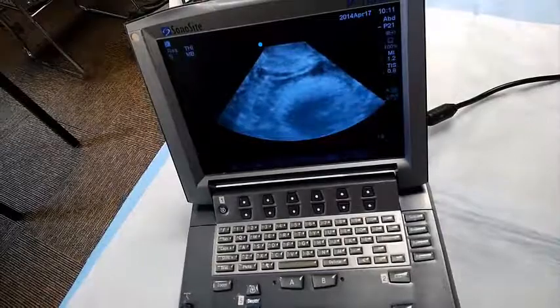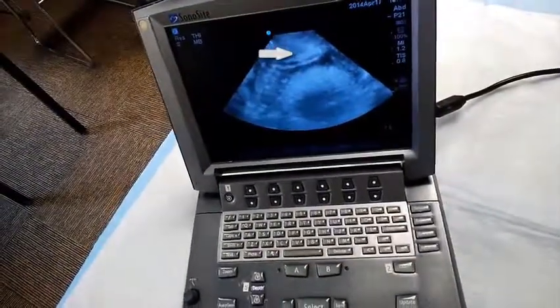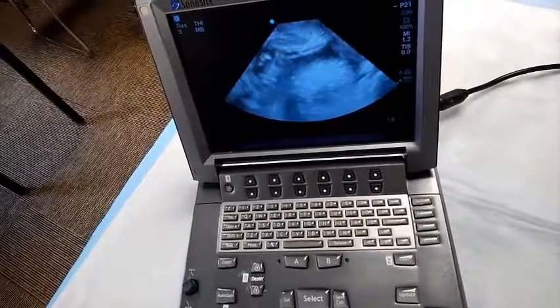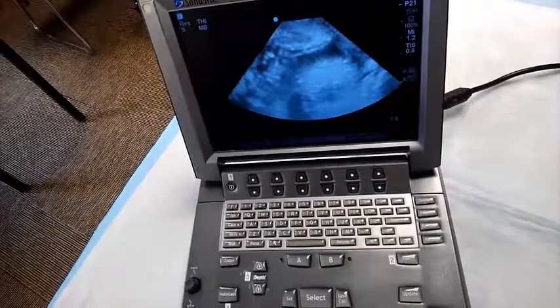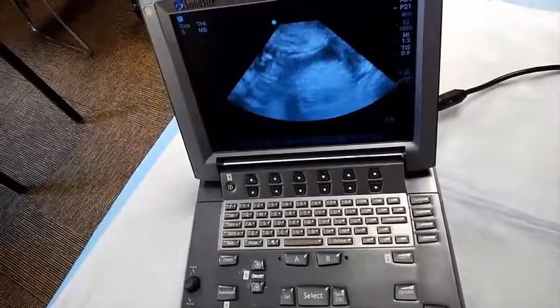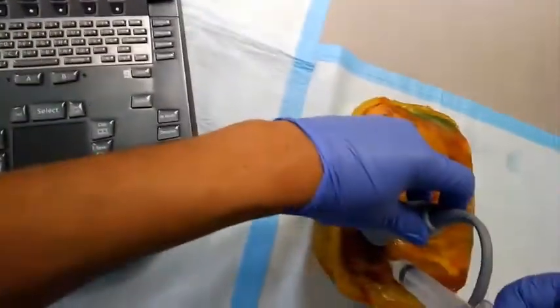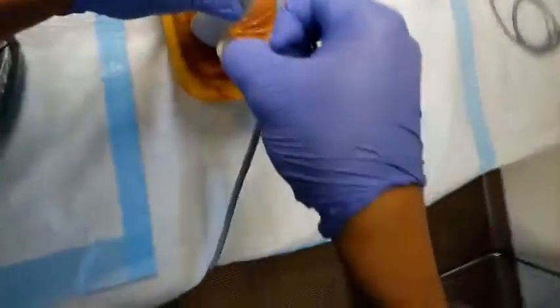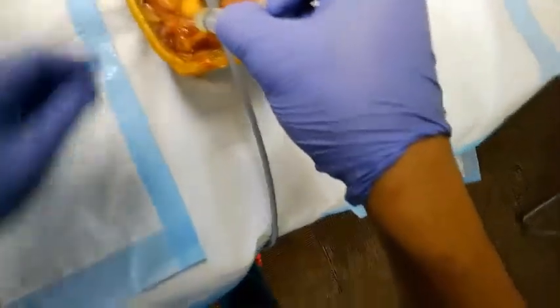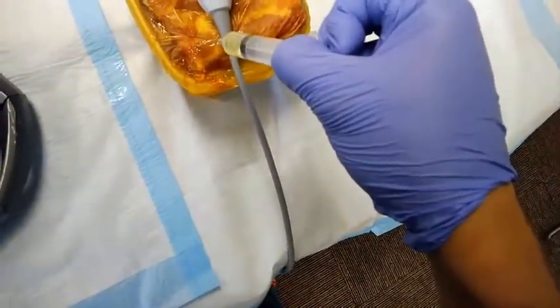Right when I see that it's tenting that pericardial sac, I get through it. I then look at the model, and as you can see, it's drawing back pericardial fluid.